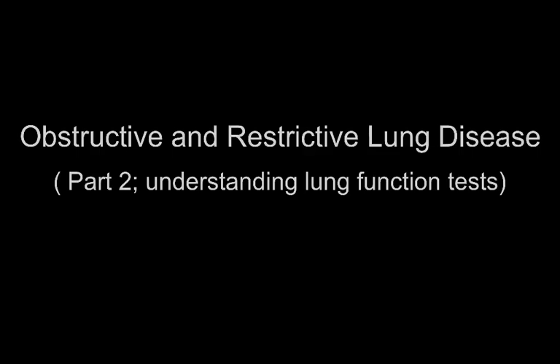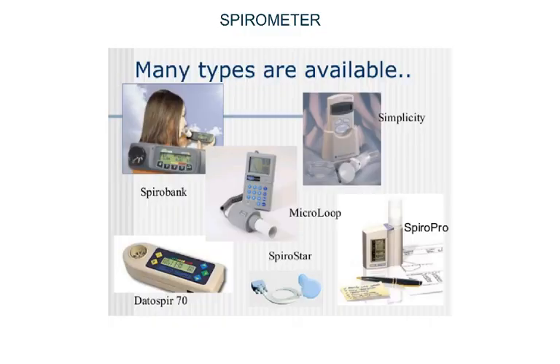Today we will discuss how to interpret spirometry results. There are many different types of spirometers, but they all have the same basic principle. The patient is asked to inhale and exhale forcefully at least 3 times into the spirometer, which then records the measurements.